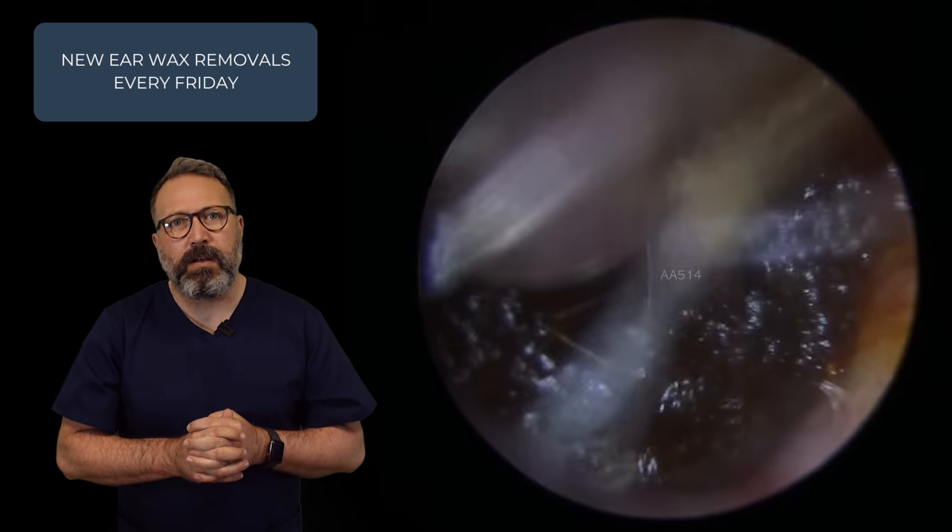We'll have a good look at this eardrum now. Eardrum looking healthy — a little tiny sort of tiny bit of a light reflex. So we have seven eighths of an inch. Look at the size of that first initial plug though — really, really dry and hard. If you felt that it would feel almost crumbly, like tablets in the UK, which is like a dry version of fudge, really, really crumbly.